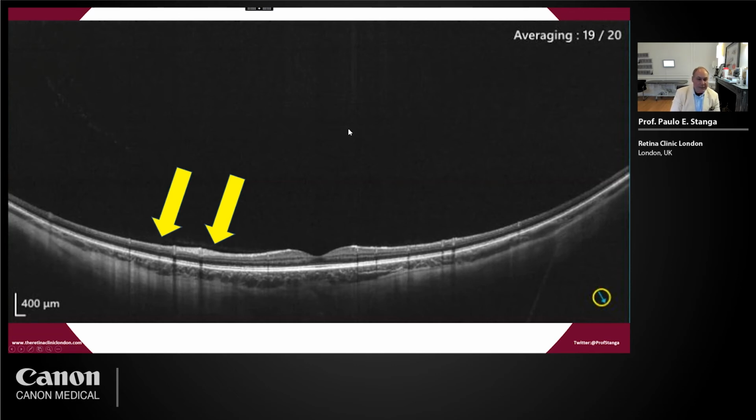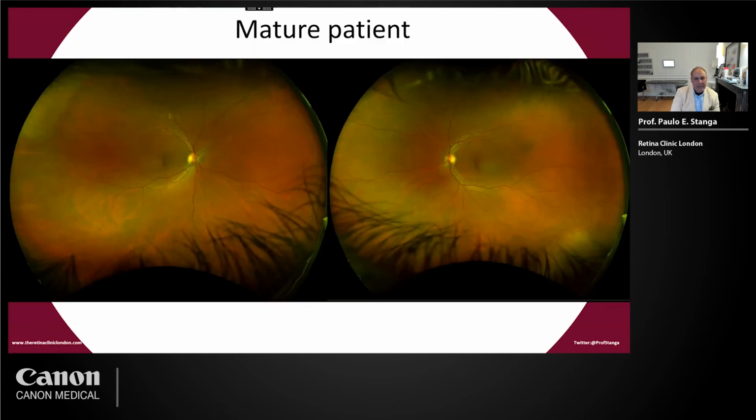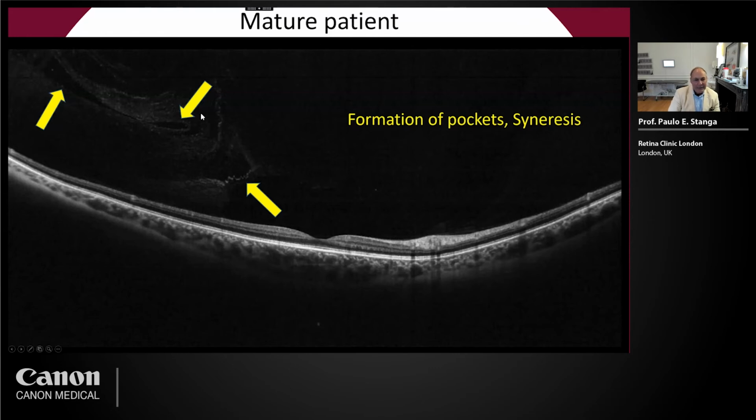declined to do. I said to the patient, this is not in your best interest. It's a single floater in the presence of an attached vitreous, a formed vitreous, not many lacunae, not syneretic. This is a mature patient, perfectly healthy fundus, and you can see the formation of pockets of lacunae and the edge of the bursa premacularis.